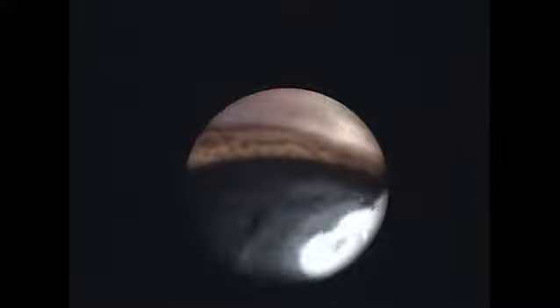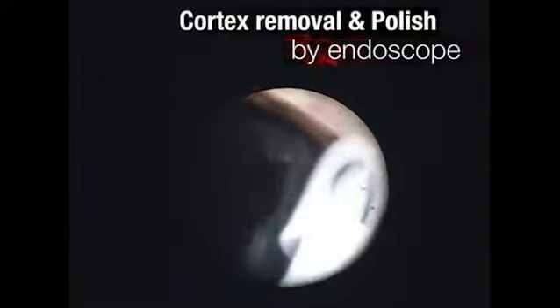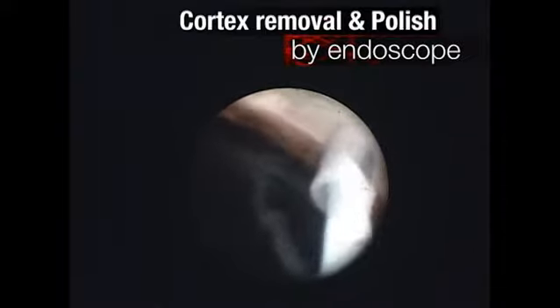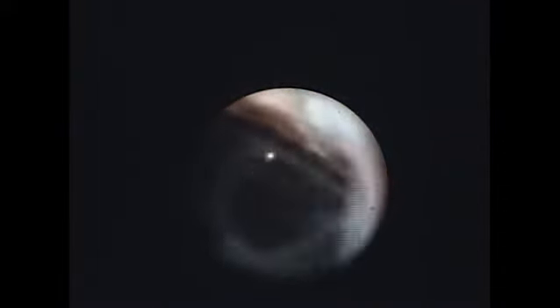Endoscopic access to the region of the capsular bag enables removal of the entire cortex, including parts hidden behind the iris or below the incision, thus ensuring that aspiration is complete. Polishing of the capsule may extend to the entire bag, preventing its contraction, which is especially of interest when an accommodative lens is to be used.